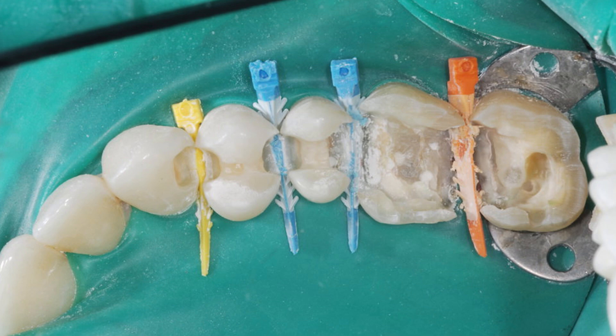Let's take a look at this picture here. We want to look at a case that is more indicative of the way I think you want to do this. This case came to us from Dr. Mike Malone — he's a lecturer who writes articles and teaches around the country. He sent us this case, and I think it's a really good example of a good way to approach a complex case.